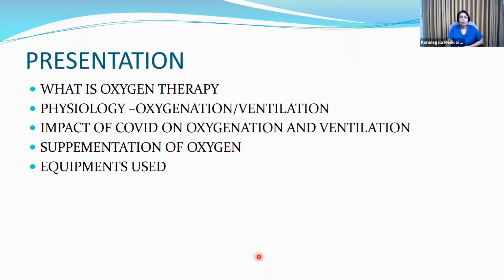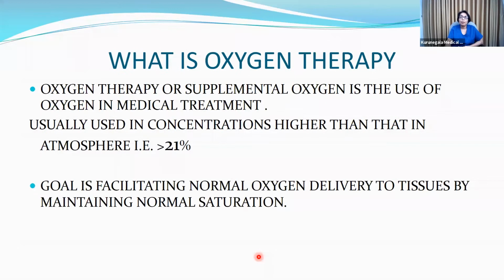What is oxygen therapy? Oxygen therapy or supplemental oxygen is the use of oxygen in medical treatment, usually used in concentrations higher than that in the atmosphere, that is more than 21%. These concentrations can vary from 21% to 100%. Why are we supplementing oxygen? The goal is facilitating normal oxygen delivery to tissues by maintaining normal saturation.